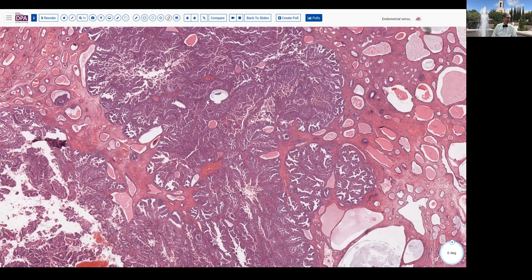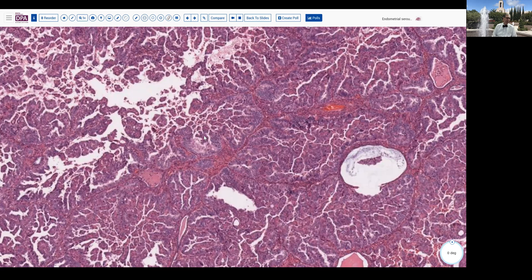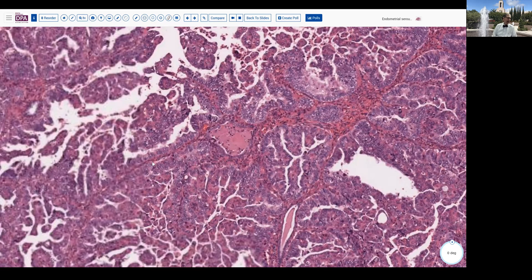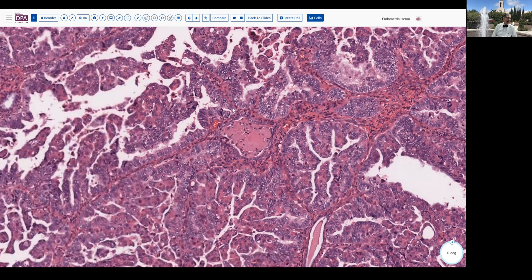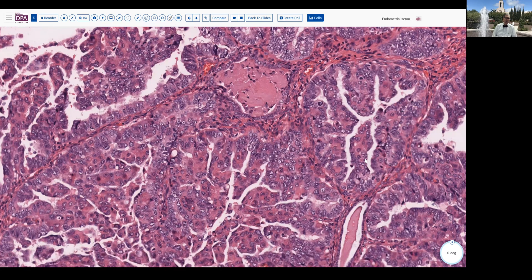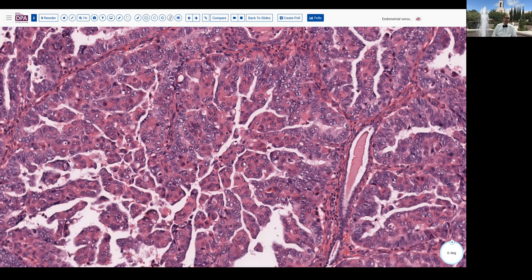As we come into higher magnification, we can see there's also a very prominent micropapillary component to this. While typical endometrial adenocarcinoma can have micropapillary architecture in some instances, it's usually not associated with a high degree of nuclear atypia. Additionally, notice that the margin here of the epithelial cells is somewhat jagged and papillary, in contrast to usual endometrial adenocarcinomas, which have a more smooth, non-undulating surface. Occasionally necrosis can be seen in the lumen of those tumors, but it is not particularly identified here.